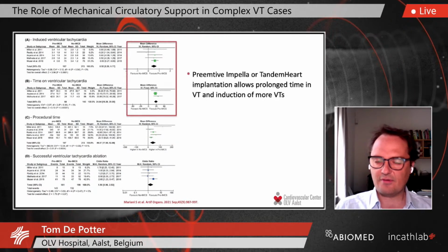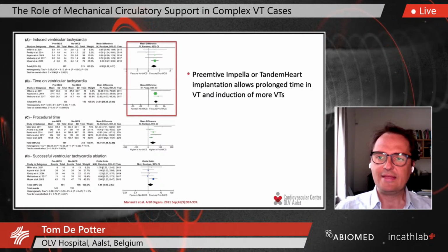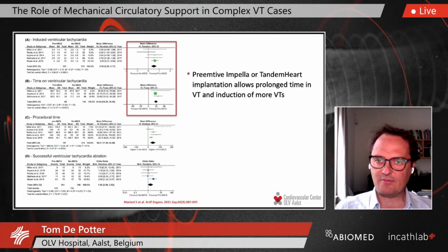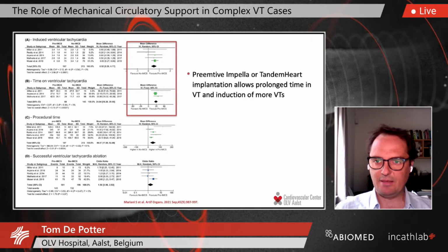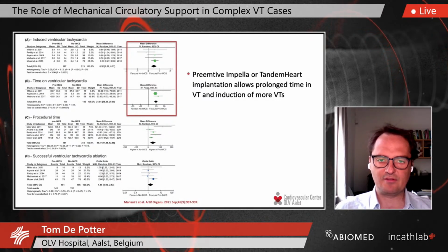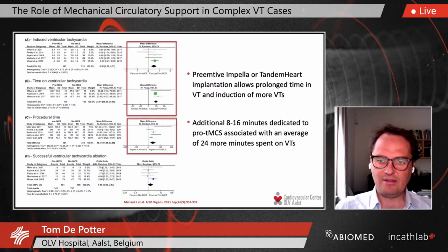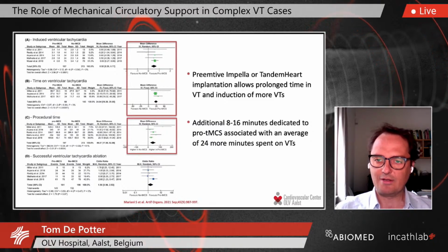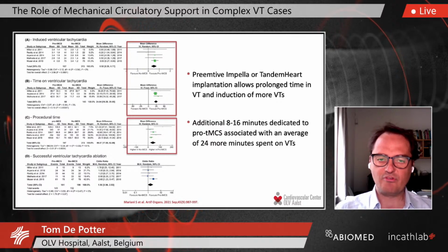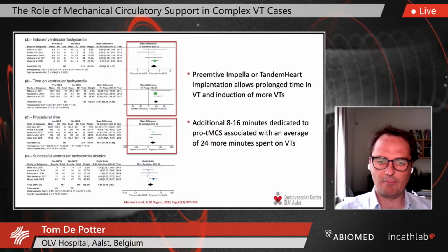In this meta-analysis, the authors report that preemptive implantation of an Impella or TandemHeart device allows, obviously, as you might expect, a much longer time of sustained VT being present, allows induction of more VTs that are much better tolerated by the patients, and thereby, of course, in these procedures, on average, an additional 8 to 16 minutes were dedicated to implanting the system, which led to an average of 24 minutes spent on mapping those VTs.